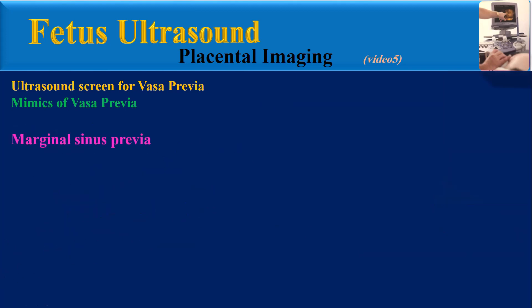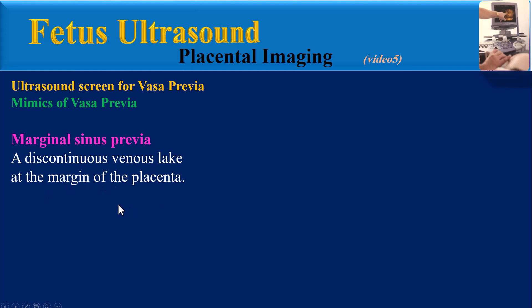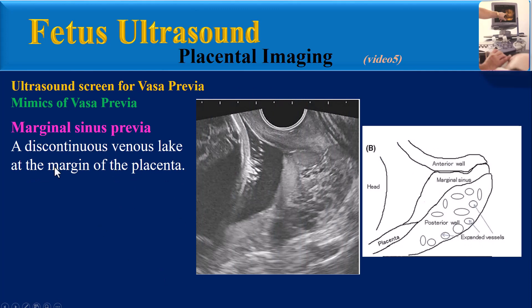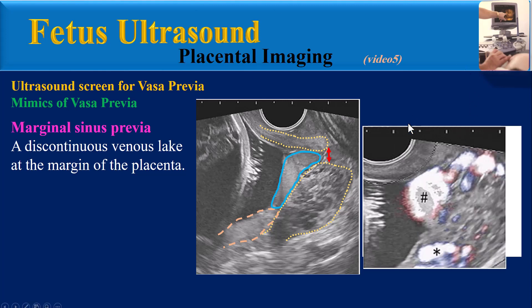Another mimic is marginal sinus previa — a discontinuous venous lake at the margin of the placenta. In this transvaginal image and schematic view, the cervix is open and the placental parenchyma is low-lying. The placental marginal sinus descends through the open cervix to the external os, and vessels at the posterior cervix are expanded. The color image shows blood flow within the marginal sinus and also within the expanded vessels at the posterior cervix, but there is no blood flow connection between the two.